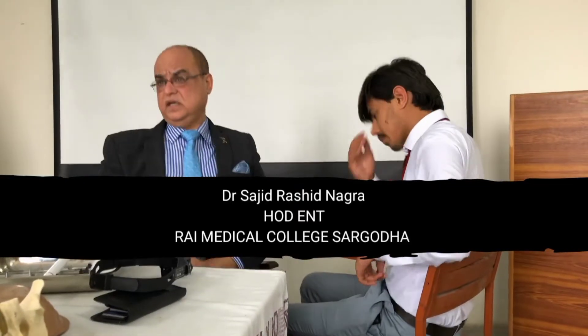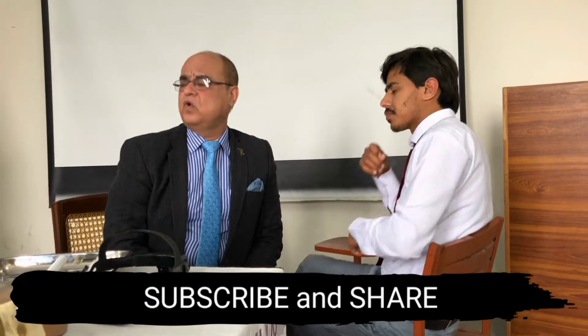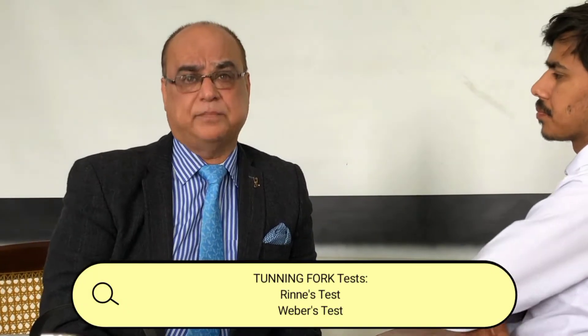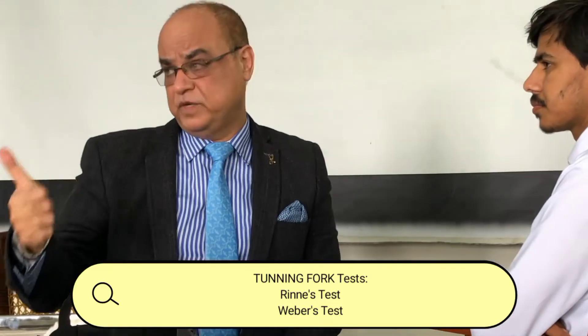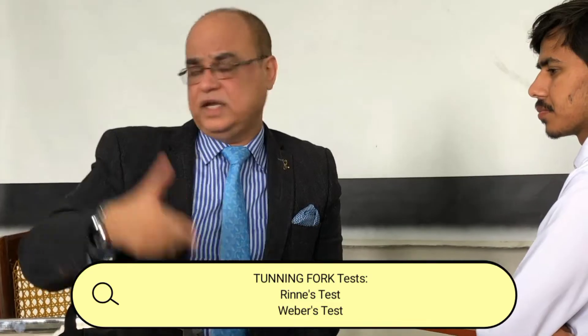There used to be more than a dozen tuning fork tests, but nowadays we have better methods to assess hearing. Still, as a protocol, you must know at least two tuning fork tests: Rinne's test and Weber's test. In addition, if you can memorize ABC - absolute bone conduction - that is okay, but we will focus on Rinne's test.